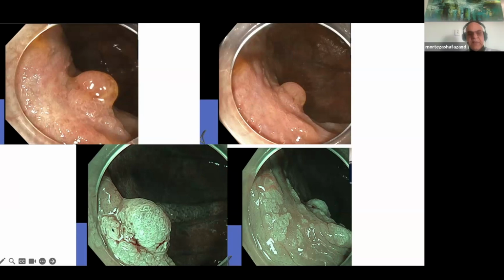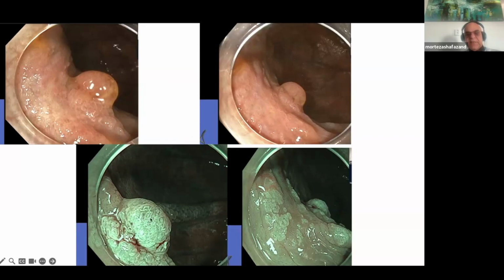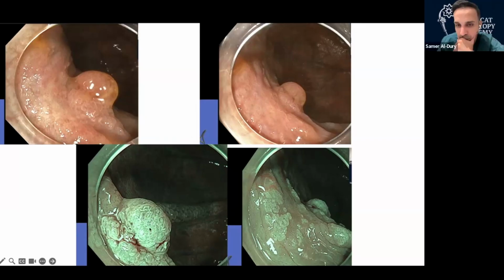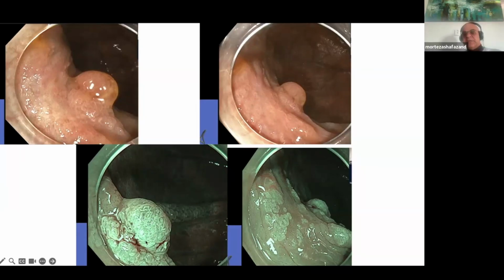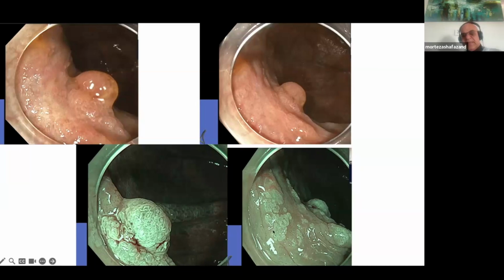Indicating that it is a sessile serrated lesion, and this is the tubular lesion with the long capillary, what we call a fusiform capillary, surrounding them. So this is an SSL turning to dysplasia. This patient should be treated completely differently, because in that report it was a cold snare polypectomy in the right colon here in CCOM. And you see, this is when I put the acetic acid. I showed you those pictures.